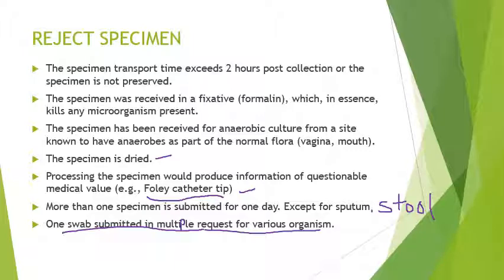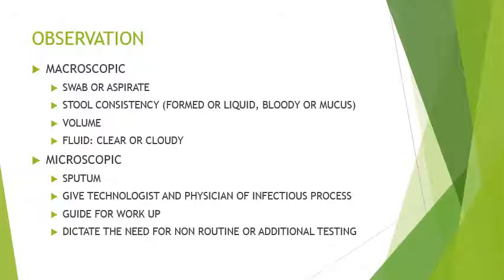Dapat for swab, remember, if you're dealing with swab, it needs to be at least 2 swabs. 2 swabs for wound culture or 2 swabs for rectal swab. Okay? 1 for gram stain, 1 for culture. If you're dealing with anaerobic and aerobic culture, dapat kung swab, kasi ang swab, hindi naman siya ginagamit for anaerobic eh. Madalang. Hindi rin naman dapat kasi na-expose ang swab sa air. Okay?